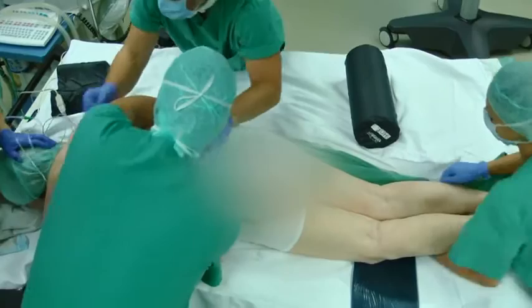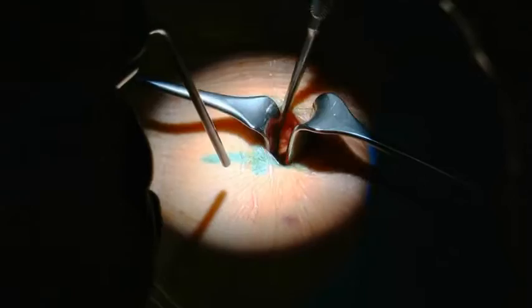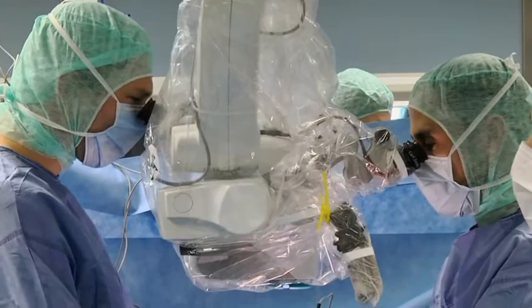The patient is placed in a prone position. The entry point for the skin incision is marked under fluoroscopic control. The fibres of the erector spinae fascia are separated longitudinally, followed by an oblique and blunt separation of the muscle fibres. The lateral aspect of the facet joint is exposed medially, and the adjacent transverse processes are marked as cranial and caudal landmarks.